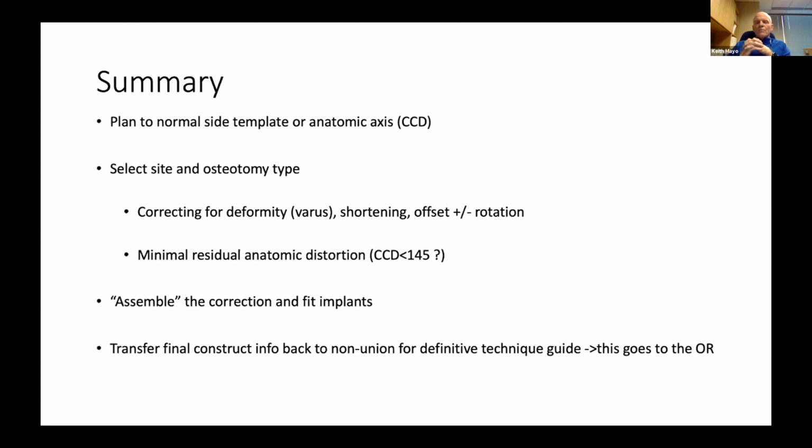And the goal is minimal distortion of the original anatomic context, so that I would never, in a situation like this, want to exceed a CCD angle of 145. There are more recent papers that document that this is still successful with a relatively low failure rate.